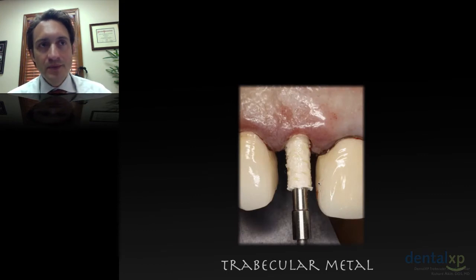Now I'm showing you the placement of the provisional abutment. In this case, I'm using a binding agent from 3M, and this is being placed into the site using the long abutment screw, which will stick up high and allow me to make sure that the provisional shell is in a good position for screw retention.